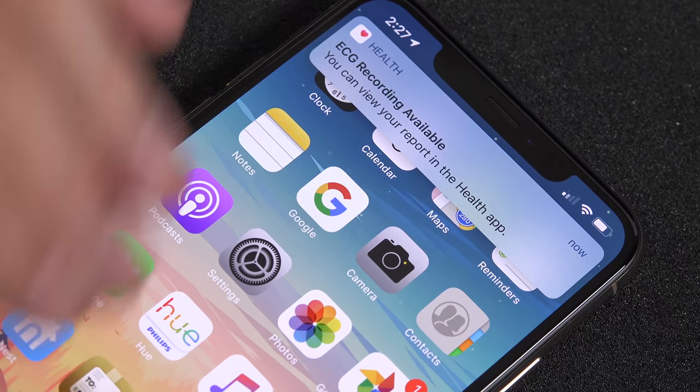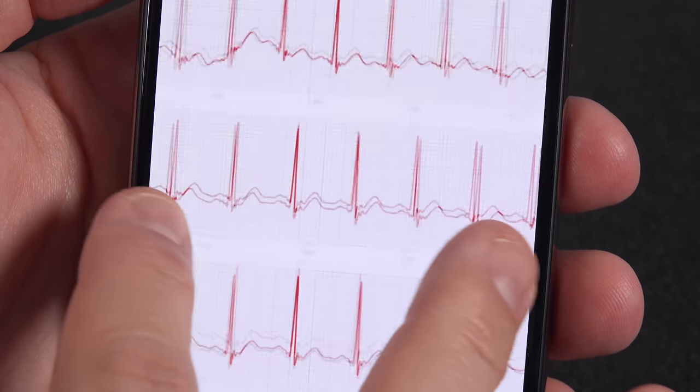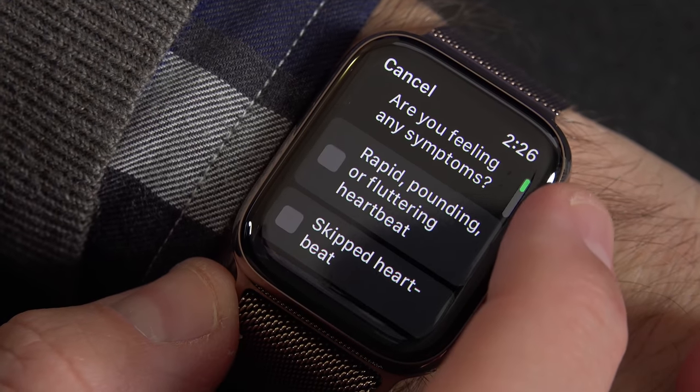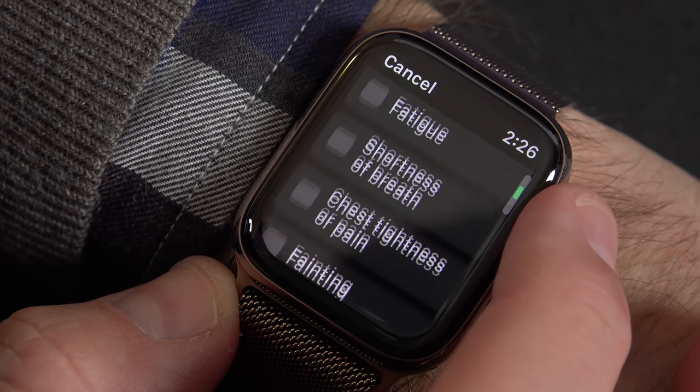To me, that's pretty amazing. You can go right to your EKG printout, save it, and share it with your doctor. Another thing you can do with your EKG readings is specify any symptoms you might have — for example, if you have any fluttering or any rapid heartbeat, you can actually mention that in your EKG recording.